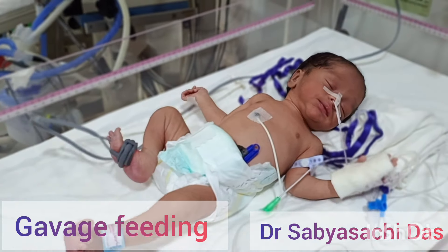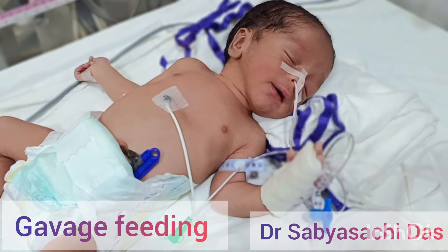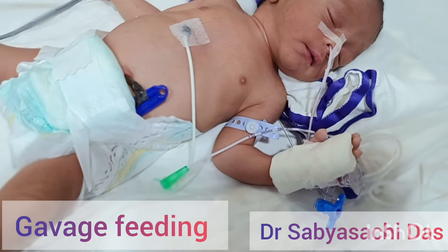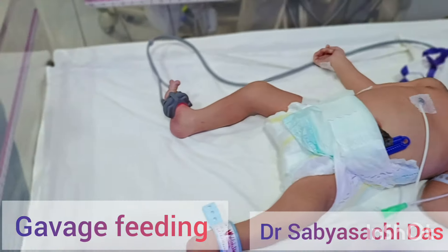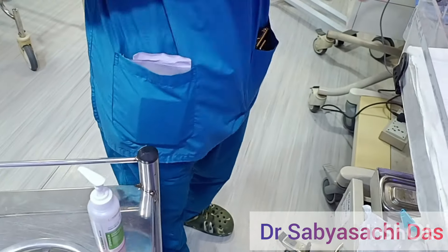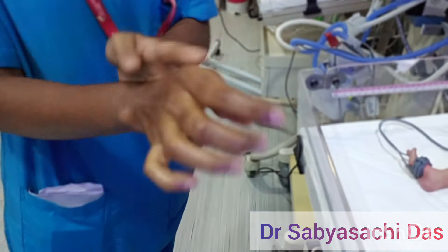Hello, welcome back to the channel. Today we are going to learn how to gavage feed a small baby in the NICU. Here we have the baby, and an NG tube, or nasogastric tube, is in place through the nose. This tube goes inside the baby through the nose into the baby's stomach. Before giving feed, we have to wash our hands with soap and water, or we can use sanitizer to sterilize our hands.